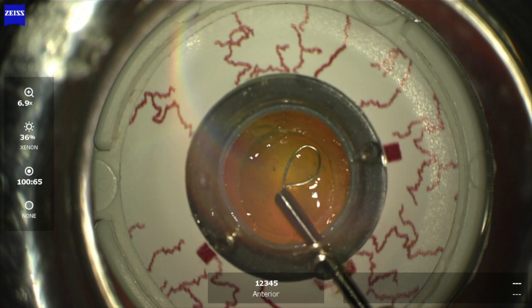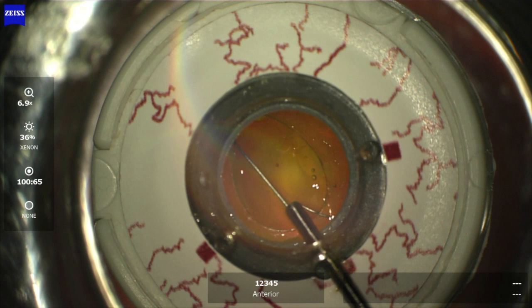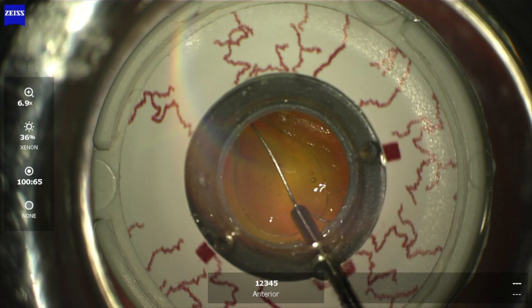Up ahead, you'll see two common mistakes with alignment. Here you can see that I am drifting left with the tip of the cannula while deploying. This is preventing the loop from expanding into the capsule and around the lens. The result is an initial feeling of resistance, then not seeing the loop sweeping posterior, and last and worse, the lens can be pushed left and displaced out of the back.